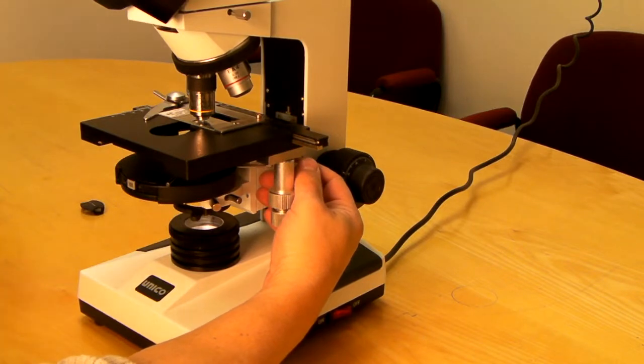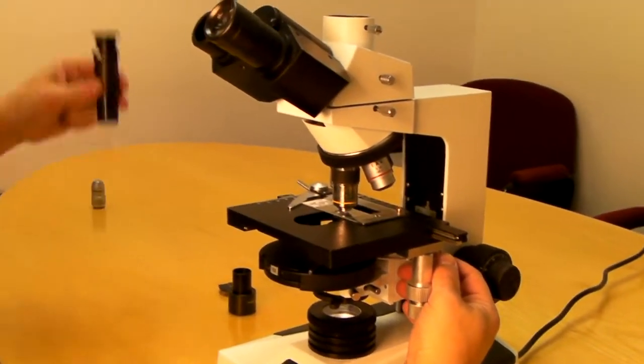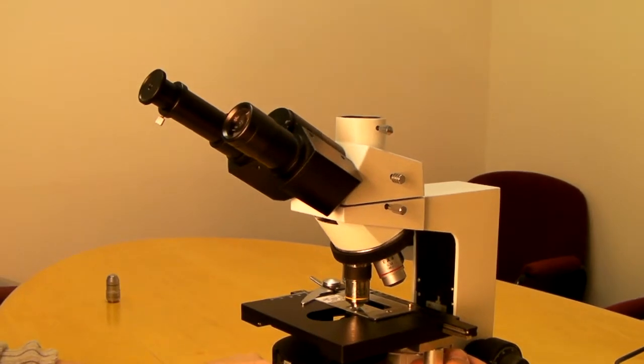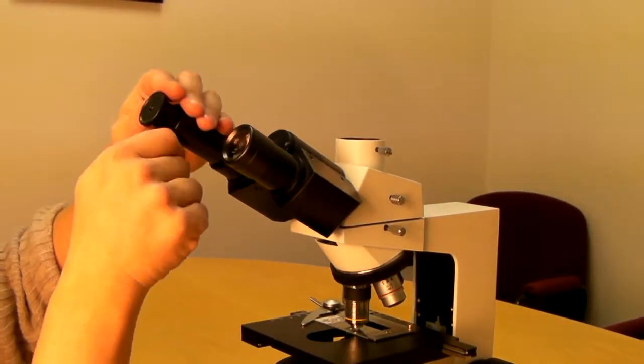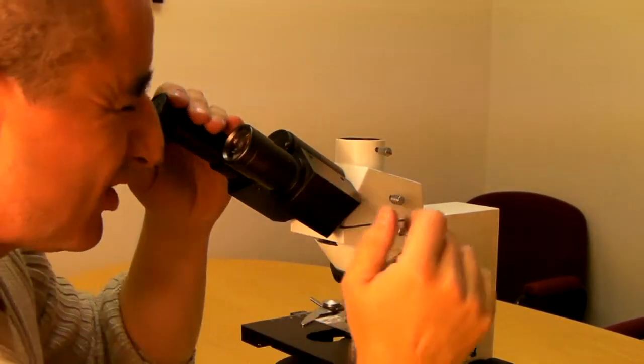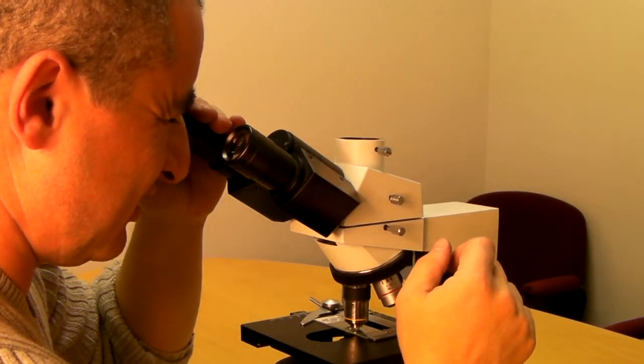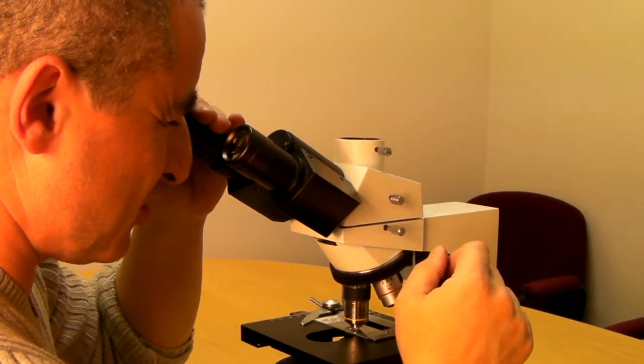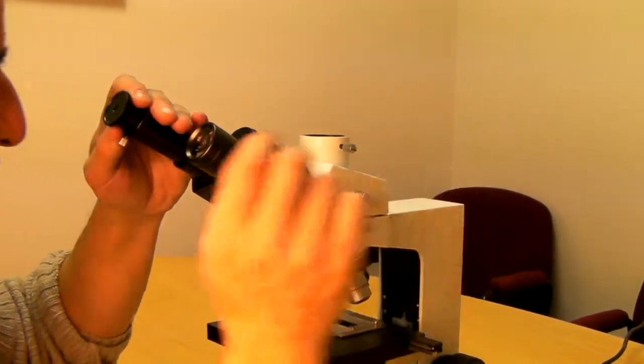Now we need to place the centering telescope first. What you need to do is look inside and make sure you will see a bright ring in sharp focus.